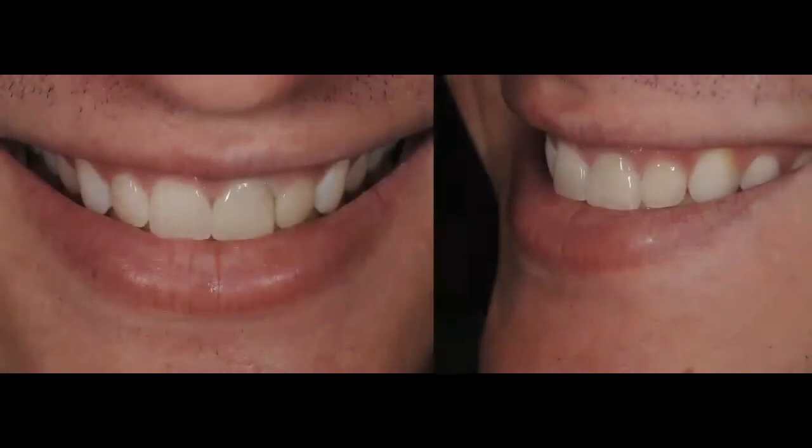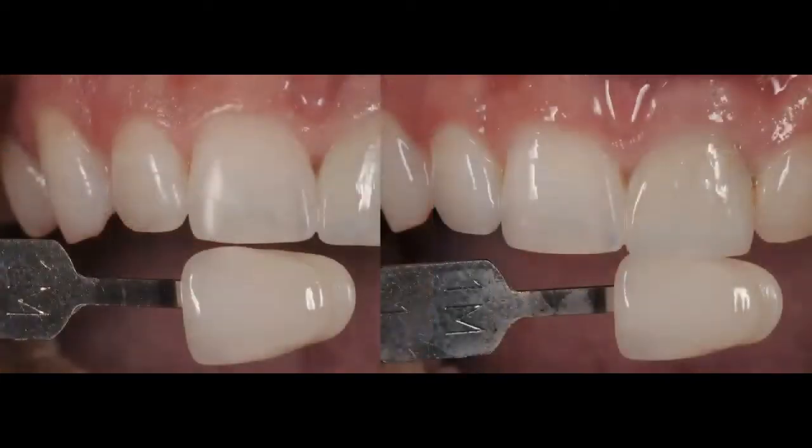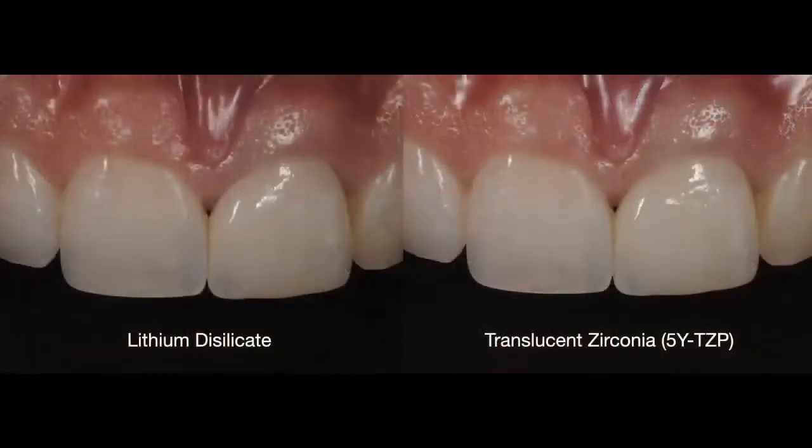Now, these are just more photos of the same restoration. I'm now giving the new lab more information. So now I have the 3D Master shade tab, and I'm choosing the 1M1. Now this one is a lot closer to that central aspect of the tooth. And now I'm sending the new lab, hey, this is what I had before. This is what they missed. I just don't want to have the same type of mistake. So what did Oral Arts do for me? What did the dental technician tell me? He understands that he may make the same mistake.